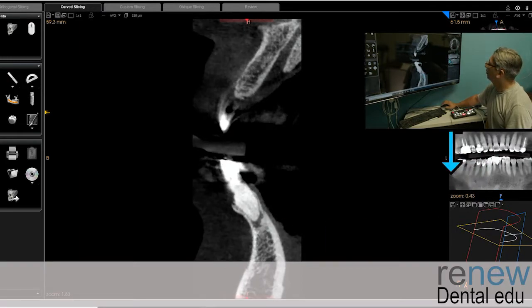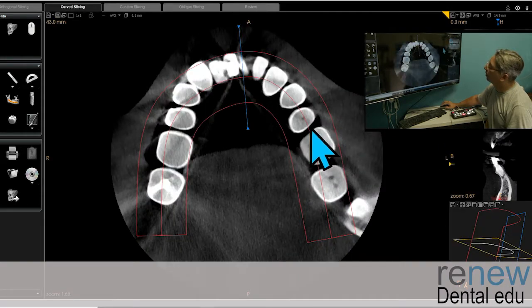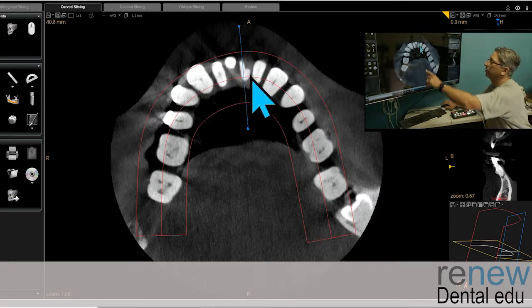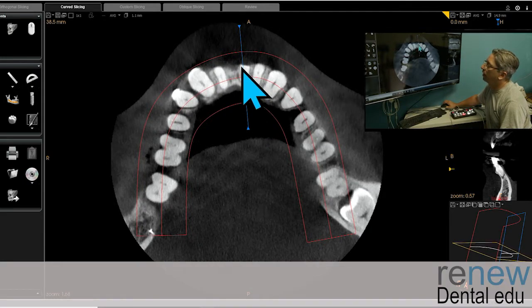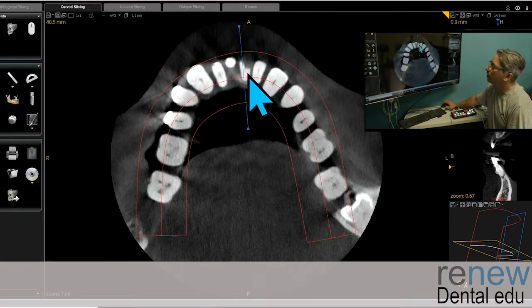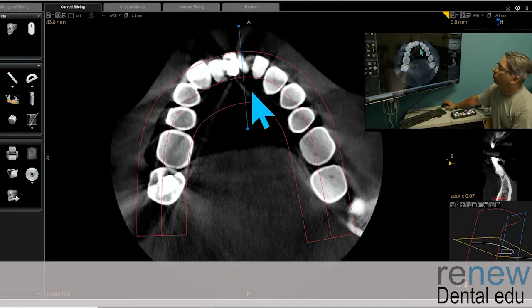Another way to look at it would be from the occlusal viewpoint, and I've got my cursor right on it right there. And as I go down, you can just see how much of that had been destroyed right through there. So that's just such an unfortunate spot. We're right on the bone. And it's nothing like you've ever seen before. It's just clean. There's no decay, and this hygienist just really ripped apart the tooth, not really knowing just how powerful that laser actually is. So that's quite damaging.